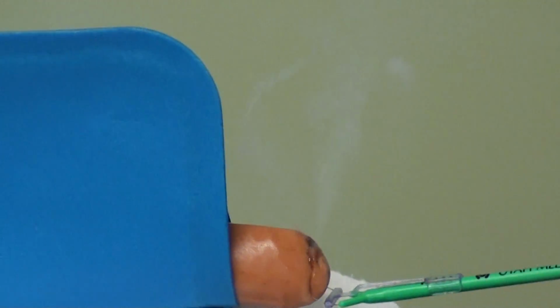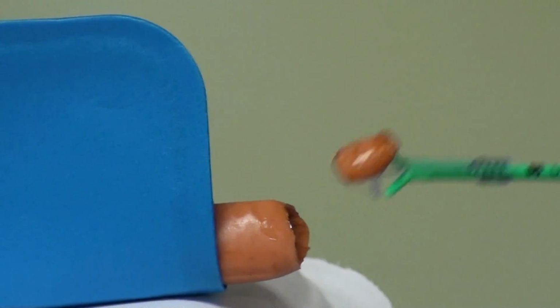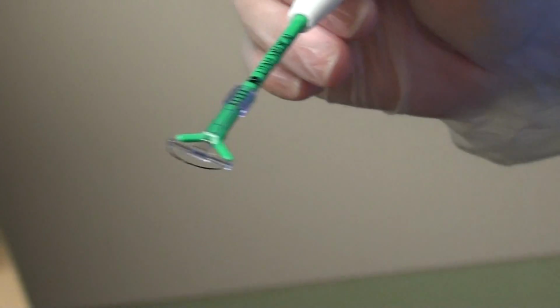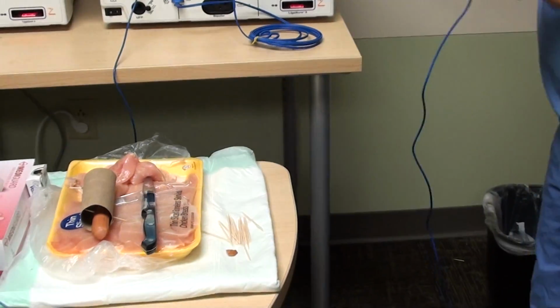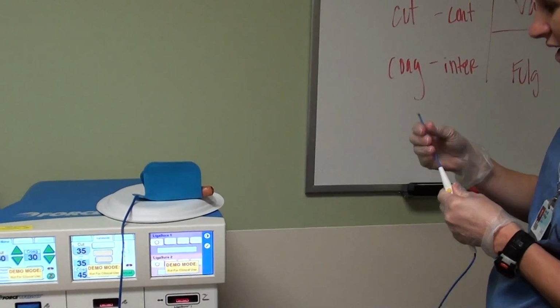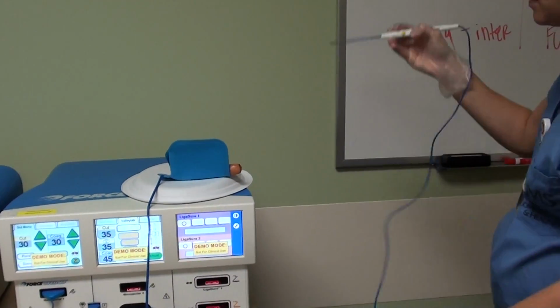make our way through. And as you can see on the specimen, there's minimal charring. So this would be a good specimen for the pathologist to read for you, because you don't have much thermal spread. Secondly, typically in a LEEP procedure, you would have some bleeding from the LEEP bed.